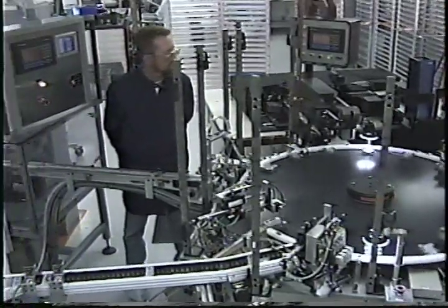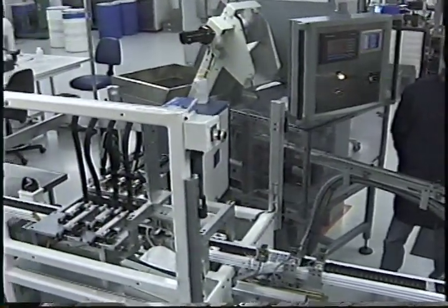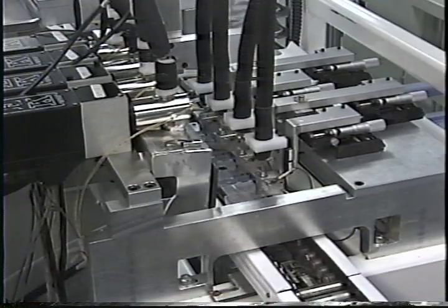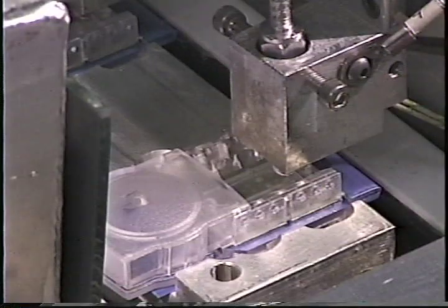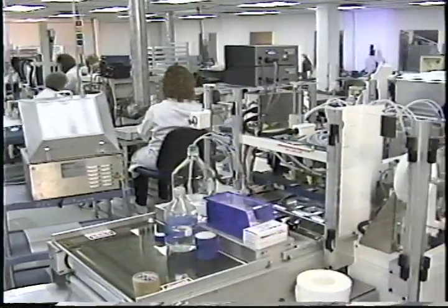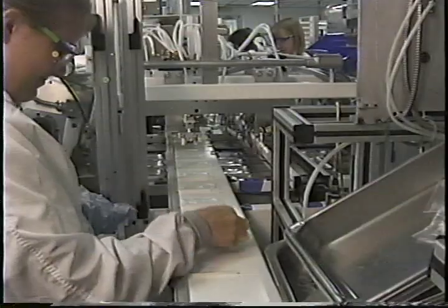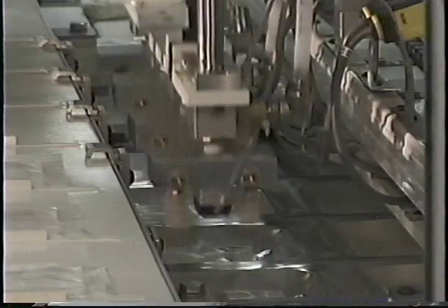Once the cartridge is snapped together, a high-powered laser cuts the lead tape that is then applied to the connector leads to prevent moisture from settling, thus avoiding sensor errors for the user. The parts are moved onto the packaging transfer system and moved into the packaging process. Cartridges move through auto-gelling, lure dispense, capping, sealing, inspection, and into the multi-vac packager. A small liquid reservoir is placed into the pouch to ensure a stable CO2 environment during shipping.